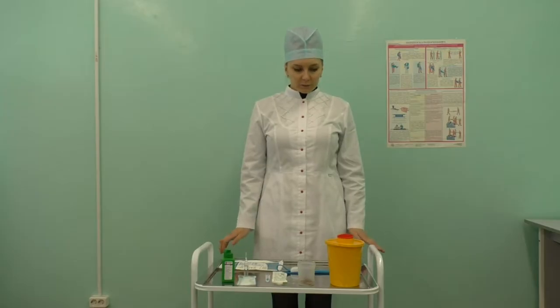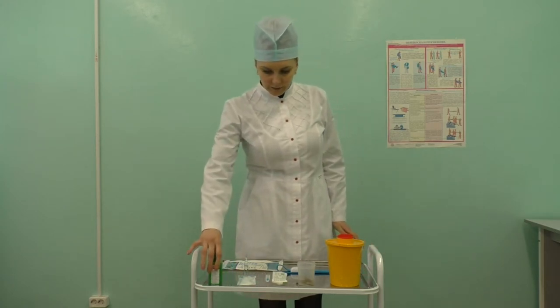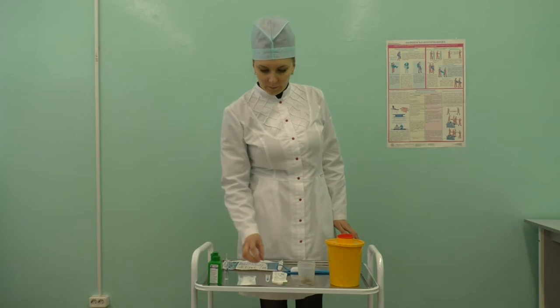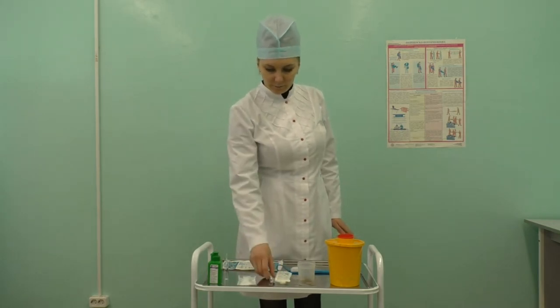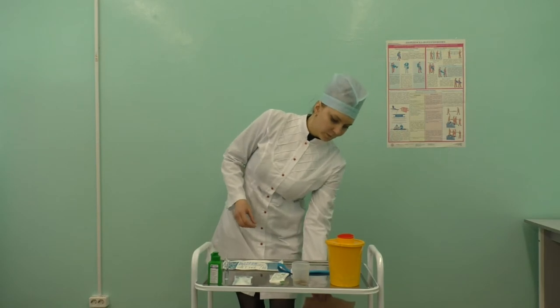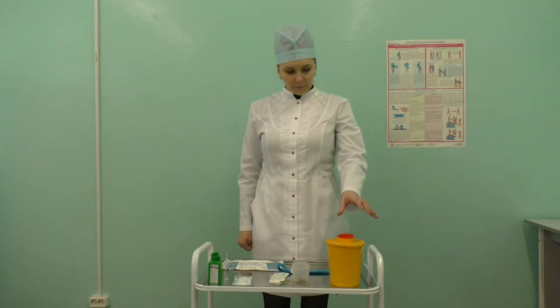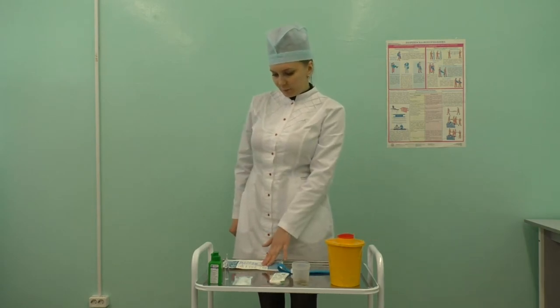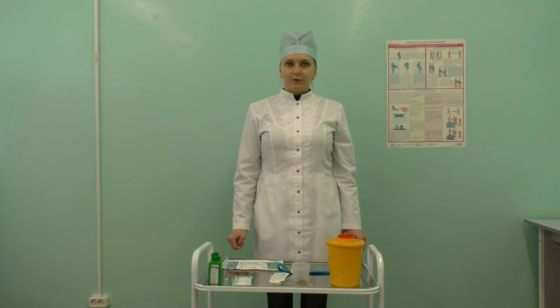Prepare all the equipment on the procedure trolley: marked waste containers, disinfectants for surfaces, syringe, ampoule or vial with medicine, solution for dissolving the medicine, needle, sterile materials, cotton wool balls, phlebotomy arm wedge, tourniquet, napkins, adhesive bandage tape, ampoule cutter, and personal protective equipment.